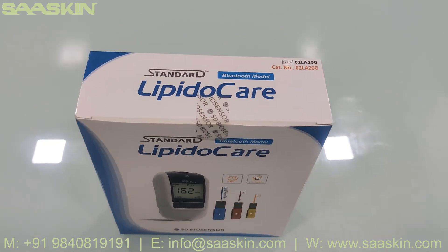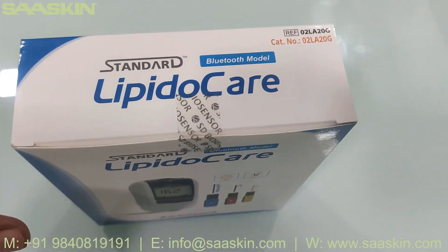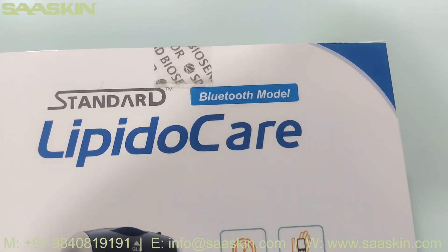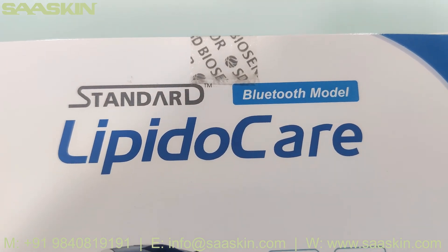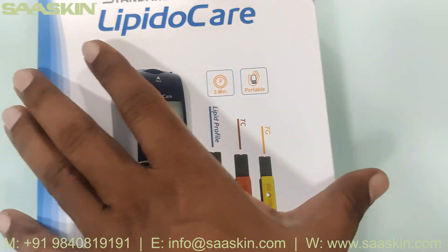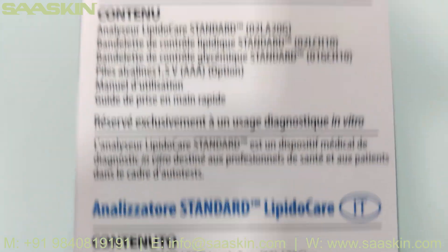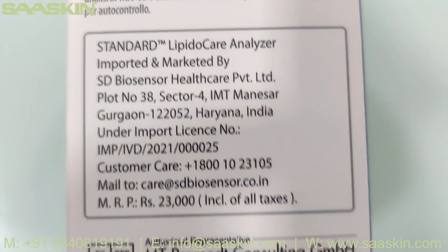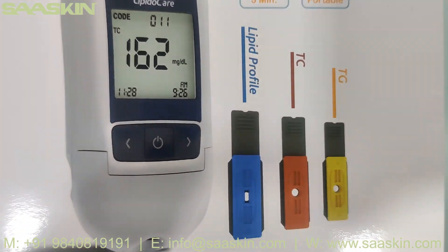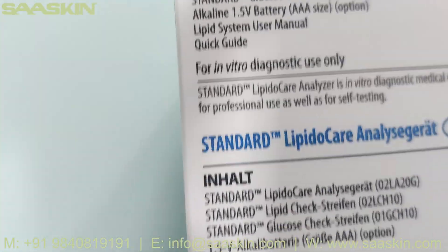Hello everybody, today we're going to see the unboxing of SD Biosensor Standard LipidoCare analyzer. This is the Standard LipidoCare system from SD Biosensor. This is what the system looks like — you can get quick results of your lipid profile. You can see the cholesterol parameters tested and even the glucose parameters are also tested in this.